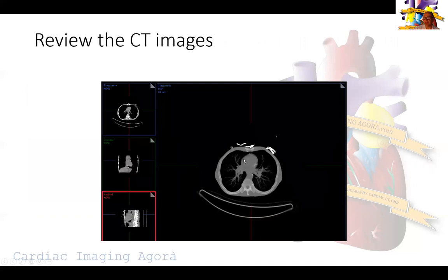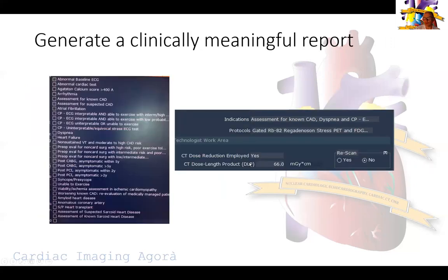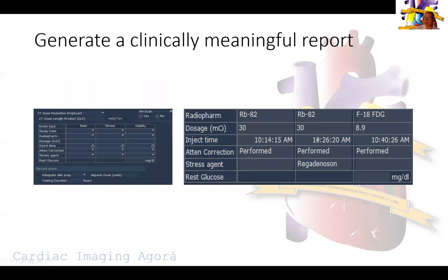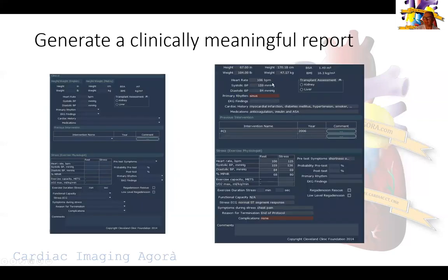Then we go back to the CT images looking for calcifications. There is calcium in the aorta and extensive calcification in the coronary arteries. For the report, we filled in the indication: known CAD presenting with dyspnea, shortness of breath, and chest pain. The radiation dose was a DLP of 66. Rubidium was given for rest/stress and FDG 8.9 millicuries. The clinical part documents baseline heart rate, blood pressures, medications, prior interventions, and what happened during the stress test.